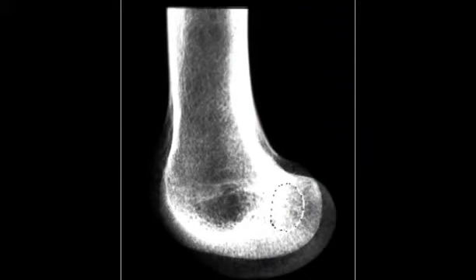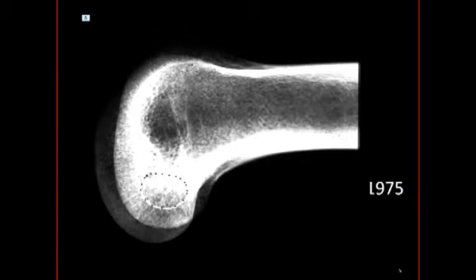In 1975, we outlined the ACL attachment on a cadaver femur using wire and made a radiograph in order to help determine the accuracy of the femoral drill hole placement on postoperative films. It was obvious that all of the ligament attachment was posterior to the plane of the posterior cortex of the shaft. This was apparent on a view with the femur in the anatomic position, but with the femur horizontal, one could, with inadvertence, tend to mistake a posterior position for an inferior or lower one.